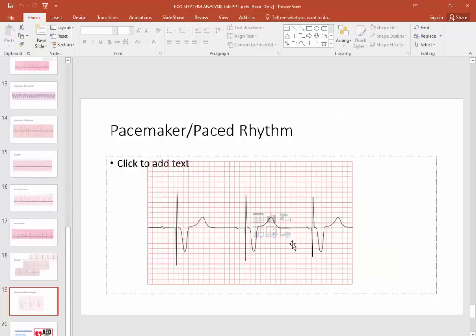And then we have pacemakers. Some people, their rhythm is goofy that they need a pacemaker installed. So they have an artificial device that's stimulating the ventricles. So you see this straight up and down line. This is called a pacer spike, which indicates that the pacemaker is driving that ventricle to contract. The atria are not doing it. So there's some blockage from the signal at the SA node to the ventricles. So the pacemaker is creating that ventricular contraction. So look for the straight up and down spike of the pacemaker spike.